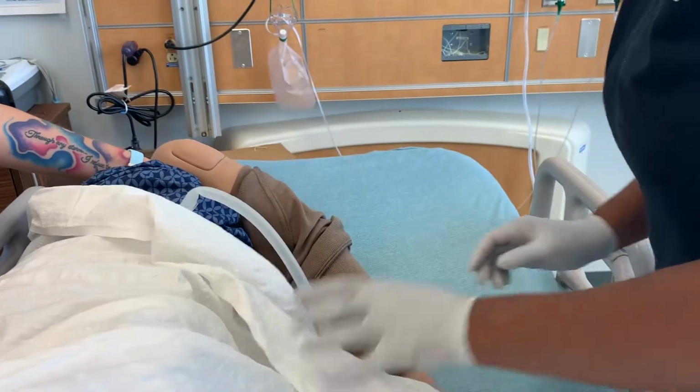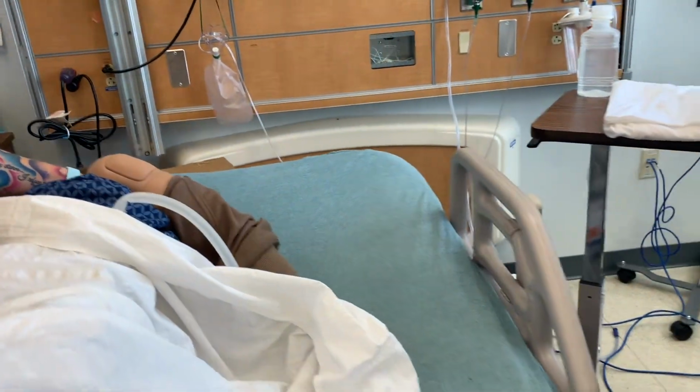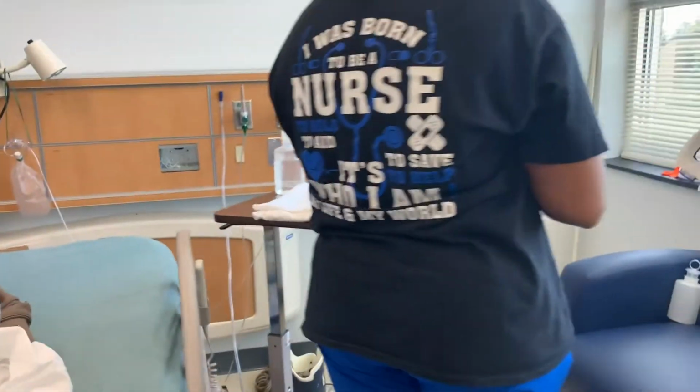Discard supplies, perform hand hygiene, and document.